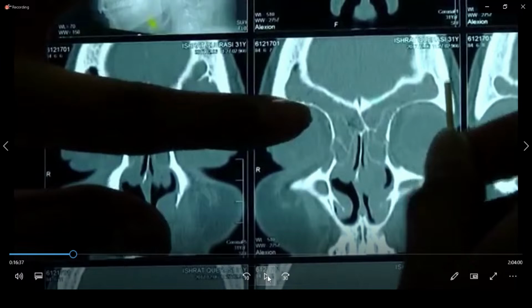And nowadays, the target for sinus surgery is not only disease removal, but to give wide openings for the future introduction of topical steroids to prevent the disease from coming back. So in this case, I'm going to take you through the important steps of sinus surgery. Why is sinus surgery discussion so important?